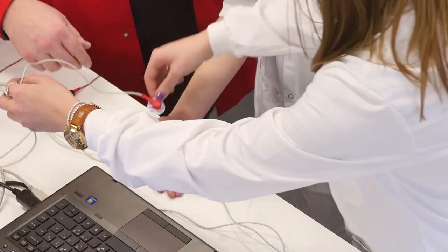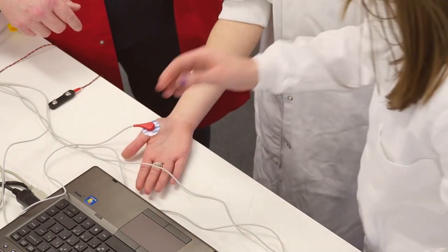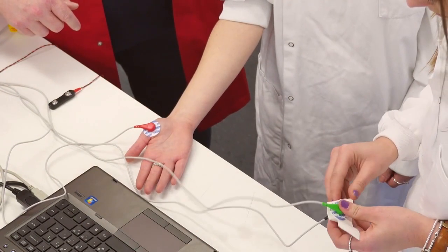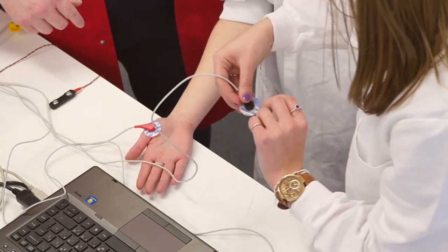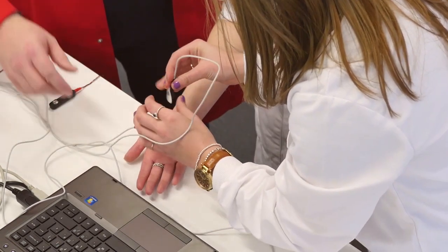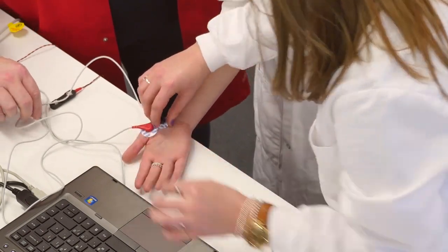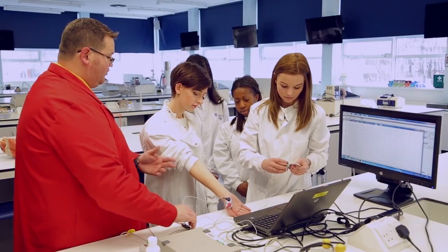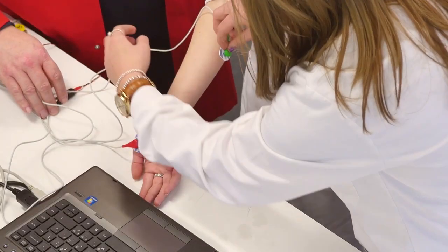The positive electrode is going onto the thumb, and then the negative electrode goes next to it. The earth electrode will pop up the forearm — essentially so that it's out of the way of where we're actually going to be stimulating.